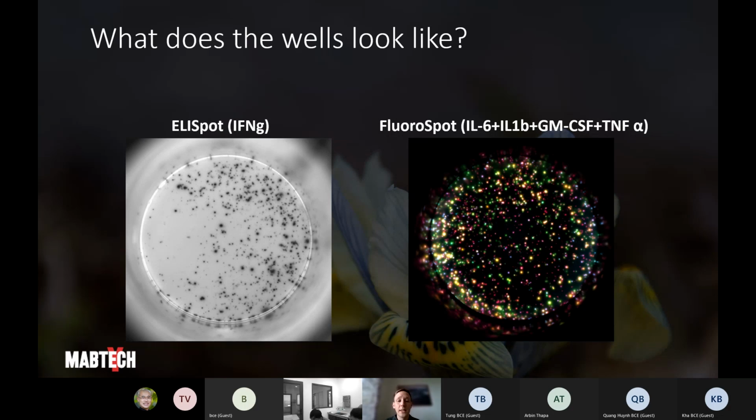So this is a way of looking at the immune cells, their memory, and what they have been exposed to. It can also be used for vaccine research to evaluate potential vaccine candidates that are triggering the immune cells so that they build up defense, and so on. So that is what we're looking at here, and the method is comparing spot numbers.